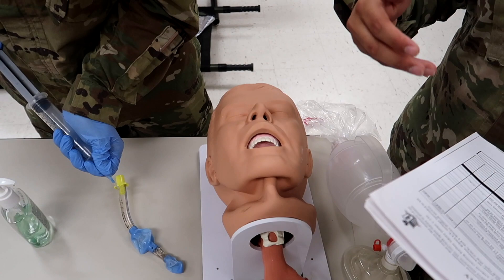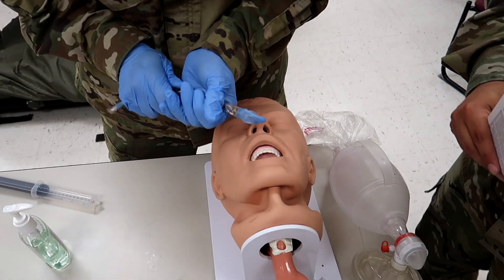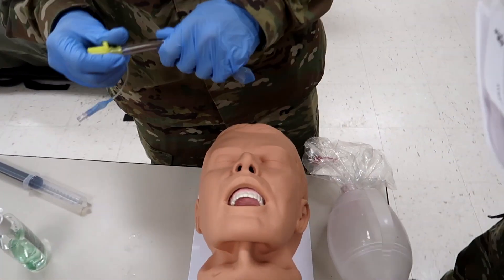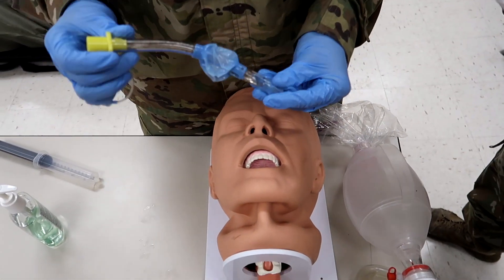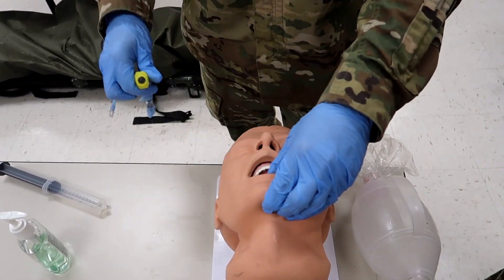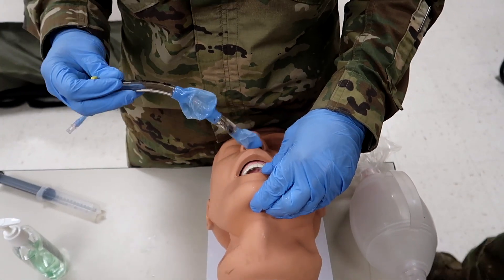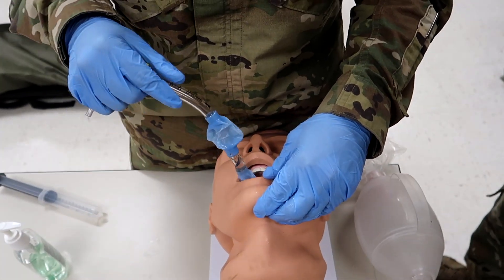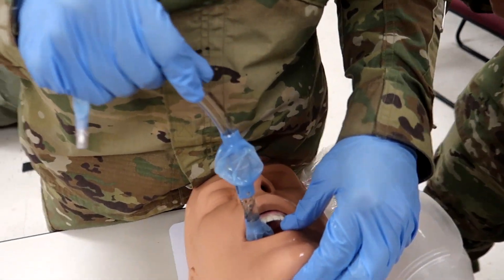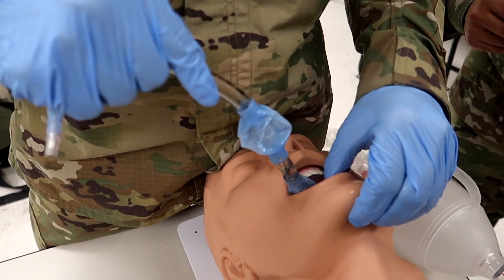Now that he's applied lube, he's going to position the head in the sniffing position. You will verbalize that the alternate position is the neutral position. Now that you've done that, he's going to hold the King LT at the connector with the dominant hand. With the non-dominant hand, he's going to perform a tongue/chin lift — so you guys can see it.